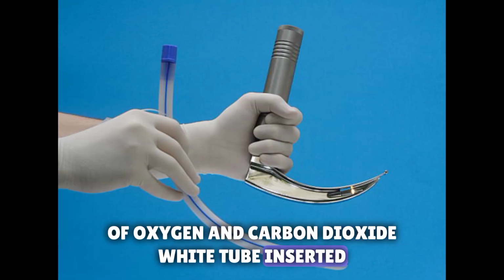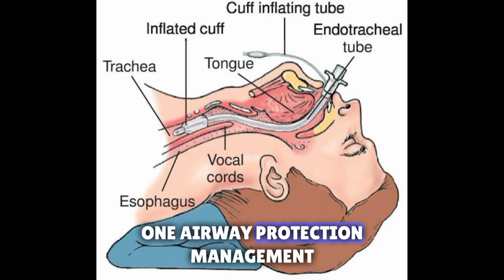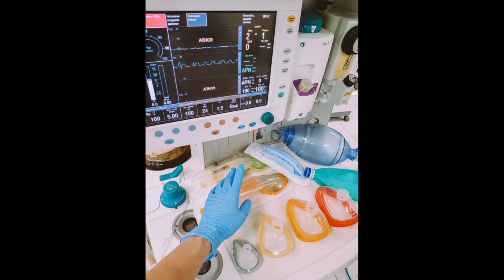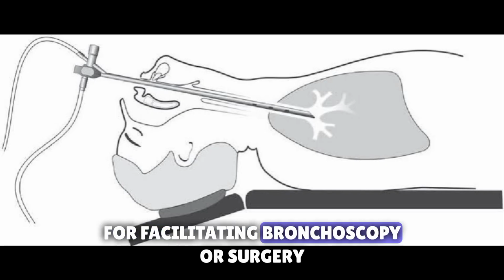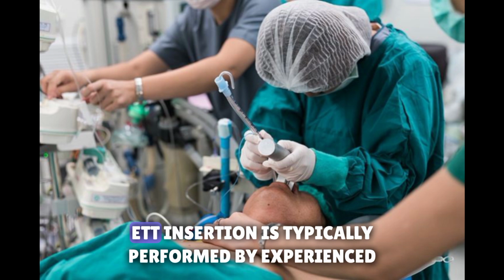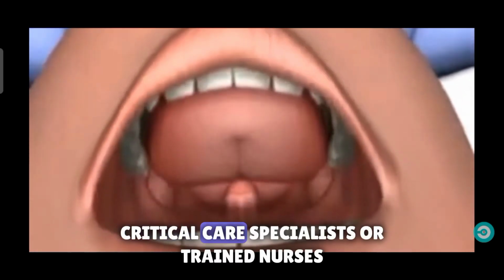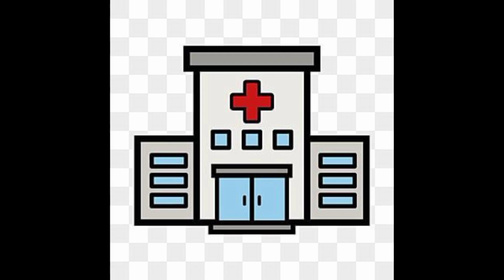Purposes of tube insertion: 1. Airway protection and management. 2. Ventilation and oxygenation. 3. Anesthesia administration. 4. Facilitating bronchoscopy or surgery. ETT insertion is typically performed by experienced healthcare professionals including anesthesiologists, critical care specialists, or trained nurses.